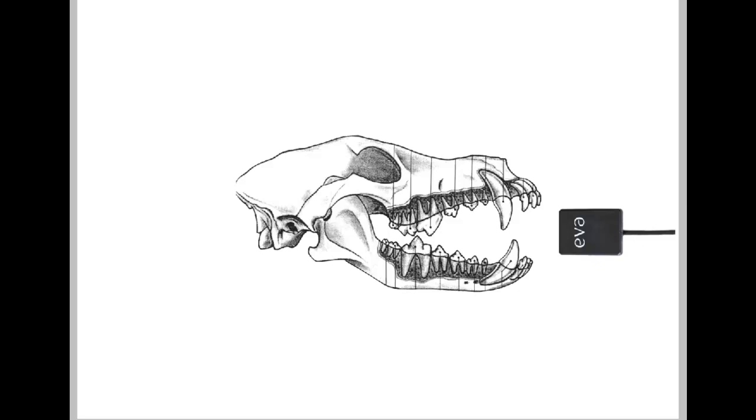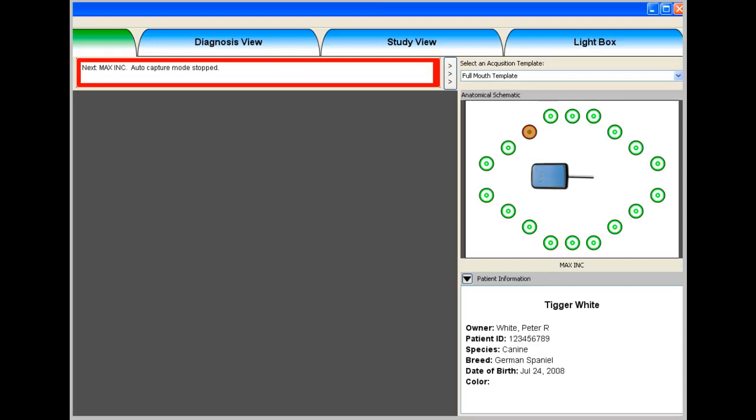And let's take a look here at how we would place the sensor, which would be for the 105, 6, and 7, and the 108 upper fourth carnassial. That would be in this landscape orientation, and the sensor would be in this position for the molar 1 and molar 2. Then I would choose either this position or this position on the chart.